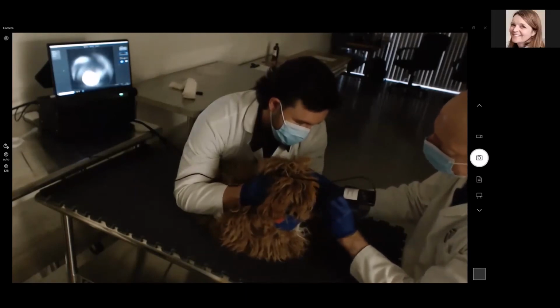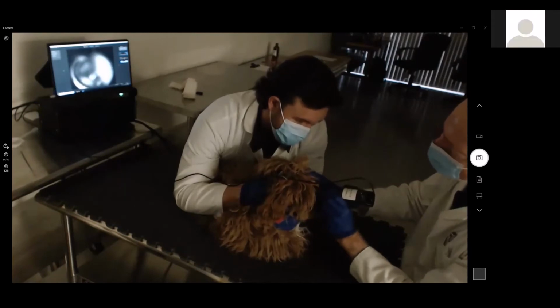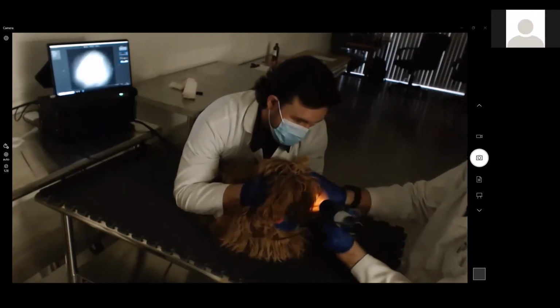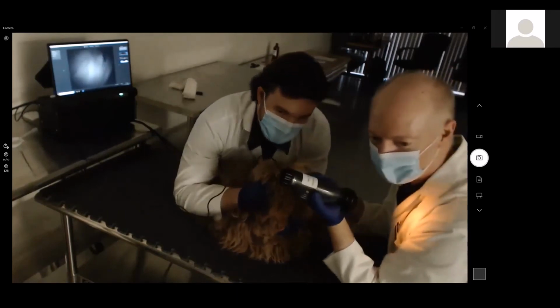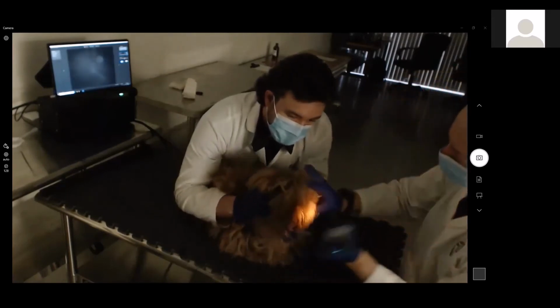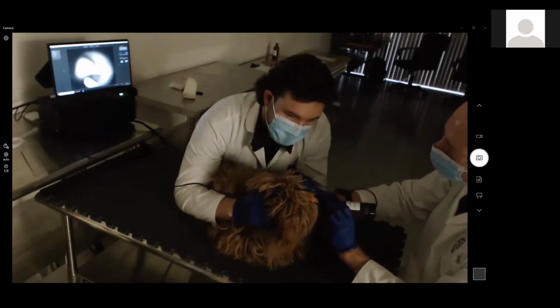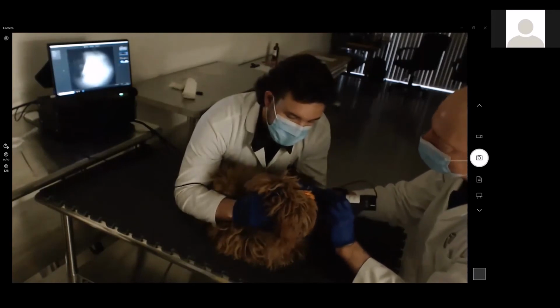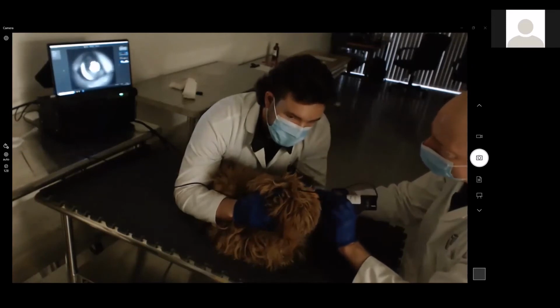Can you turn down the light intensity on that? Because it seems like your aiming intensity is kind of making them uncomfortable. I agree. One of the things about this particular design that we're checking out, Jill, is to see how this works in a dilated eye, and whether it's just letting in too much light. And the controls on the system are fairly limited, so it is a bit difficult. It's kind of bothering them a little bit with the light intensity.